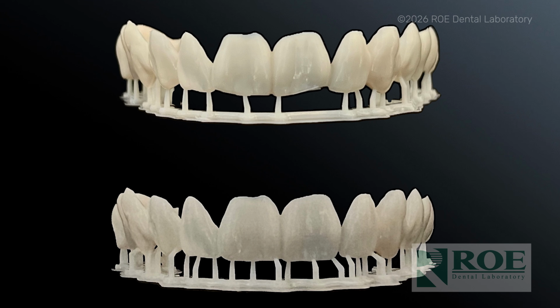This is the exact same design, exact same printer. The only thing that was changed were the support structures. Honestly, the upper one was how the software gave it to me originally. Luckily, we don't get that as much, but important step, don't skip that. Just be aware that if something doesn't fit, that's often what it is.